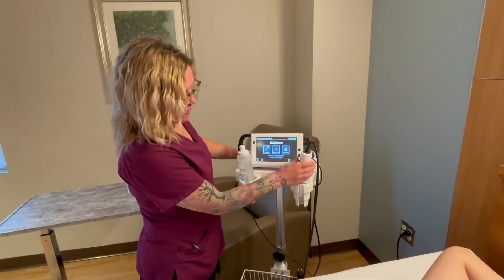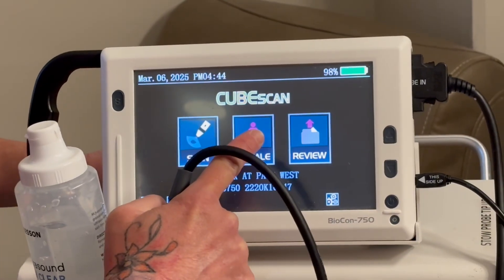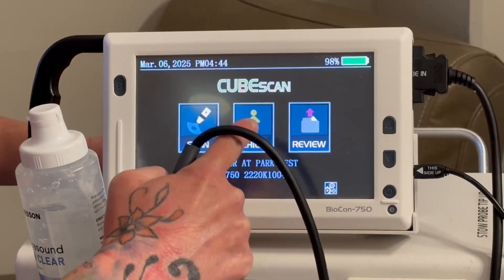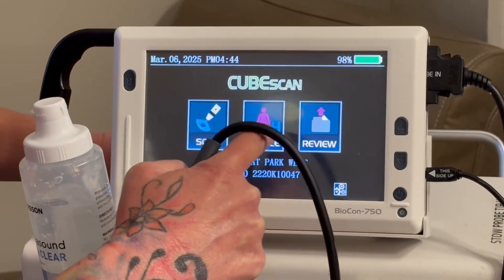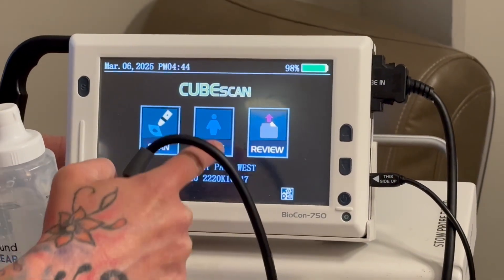The first thing you're gonna do is power on. The power button's down here, so I select it. Your options are gonna be female, child, female with the H which is hysterectomy — because it matters on your scanning results — and then male.